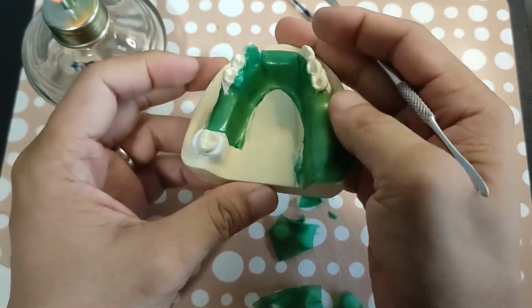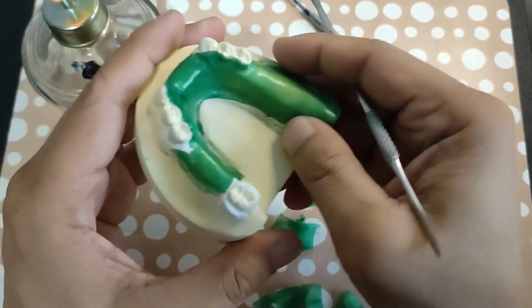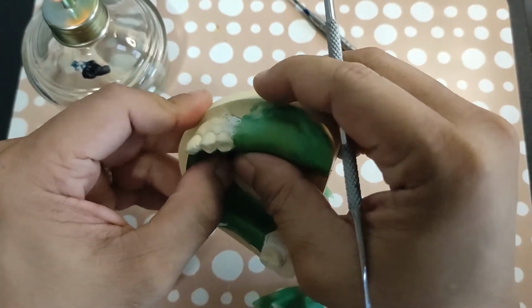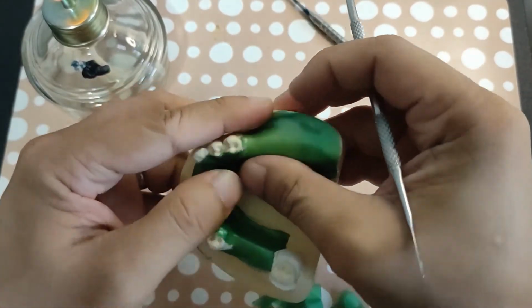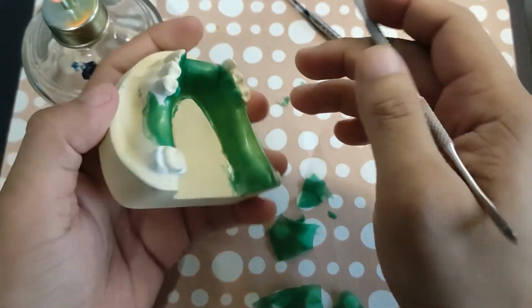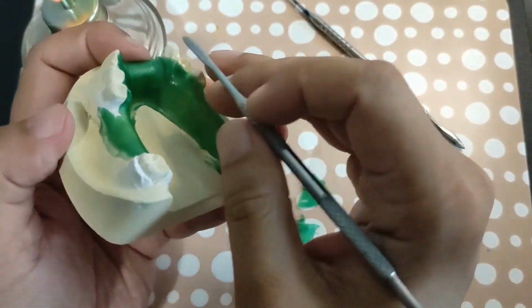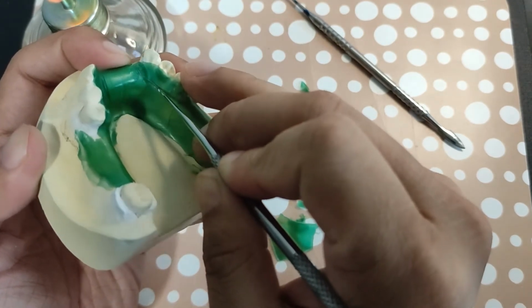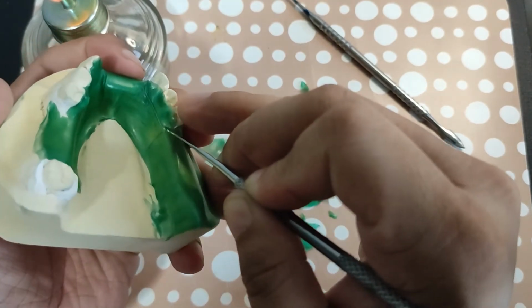Okay. So that's the first layer. The second layer corresponds to the mesh. Now, clear this first. Just make sure that the crowns are all showing.